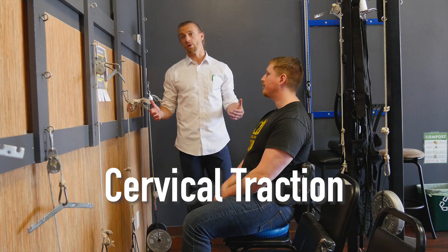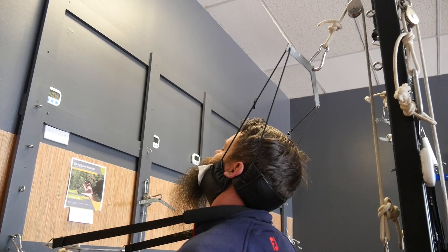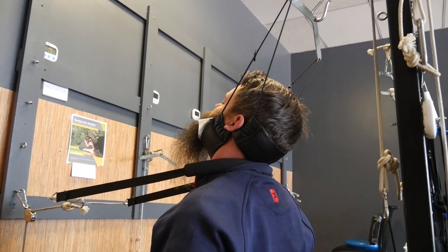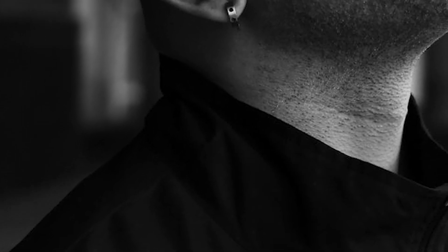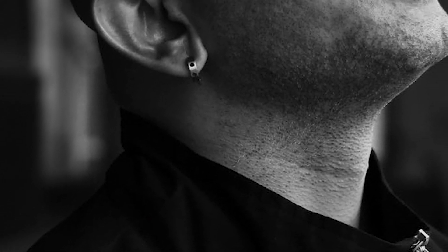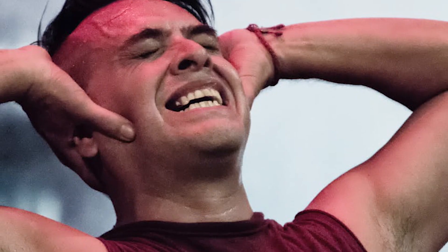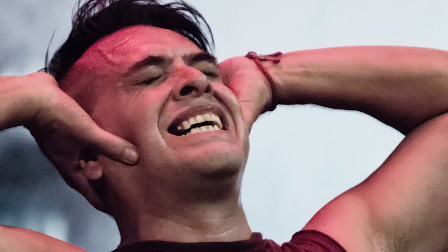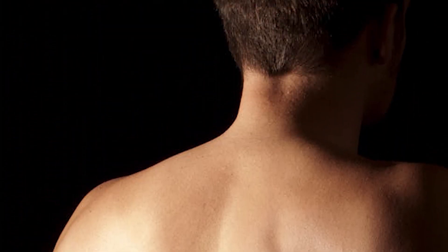We've got Joel set up here in our cervical traction, also called Pope Two Way. What we do is try to increase the cervical lordosis by inducing the neck into a more ideal position and pulling into the curve of the neck. The neck has this natural C-shaped curve, and whether we're looking at our phones, have traumas, or whatever kind of subluxations occur, we can lose that lordosis, which puts a lot of tension on the spinal cord and has tons of neurological effects.